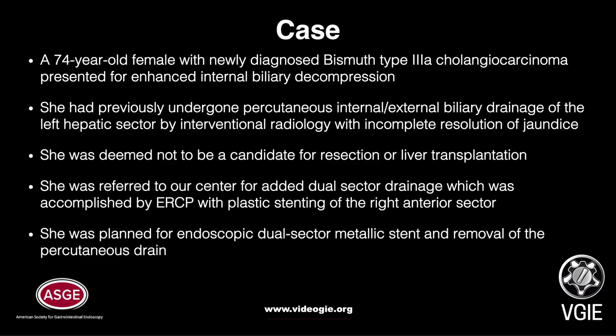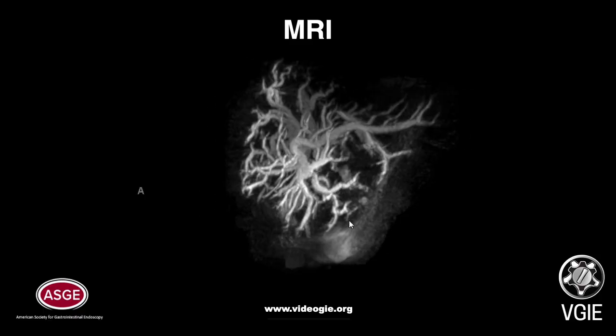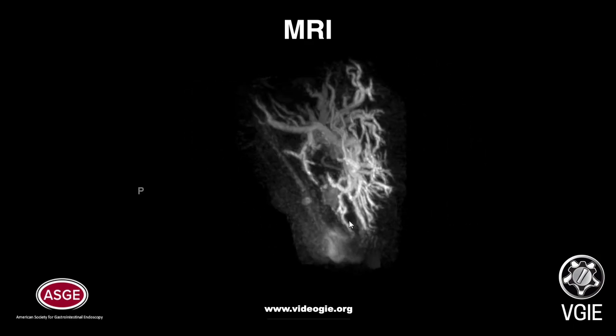She was referred to our center for added dual-sector drainage, which was accomplished by ERCP with plastic stenting of the right anterior sector. She was planned for endoscopic dual-sector metallic stent and removal of the percutaneous drain. MRCP with 3D reconstruction video shows the large volume left lobe segments obstructed by a hilar mass, with relatively small volume but separately obstructed right anterior and posterior sector ducts.